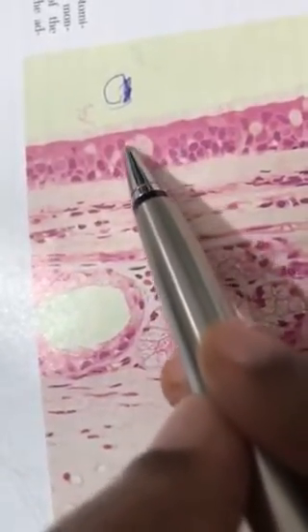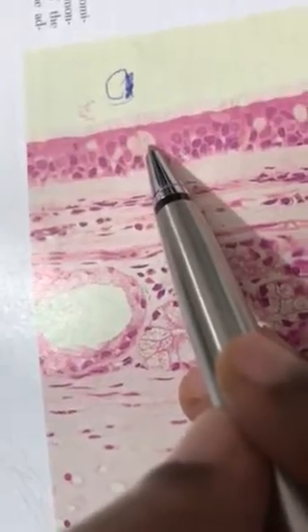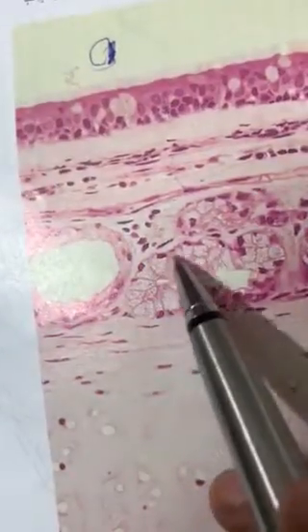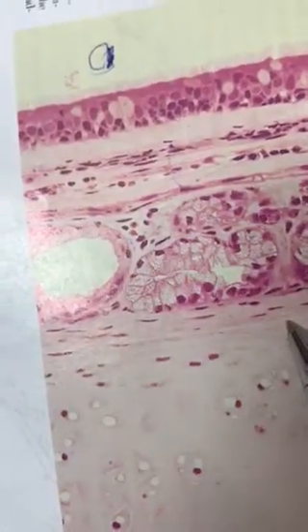Thick basement membrane. Can you see along with that some white color cells? That is your goblet cell. Why is the goblet cell white? It will not take up the stain. That's why it is white. Goblet cells and basement membrane. And lamina propria also fibroelastic, and submucosa also fibroelastic. Here you will be having some glands in this. And then you have the adventitia.